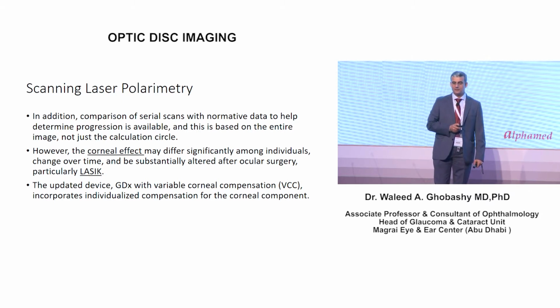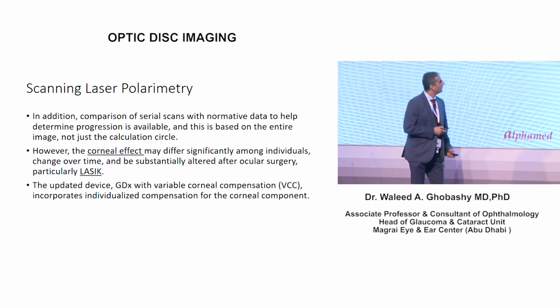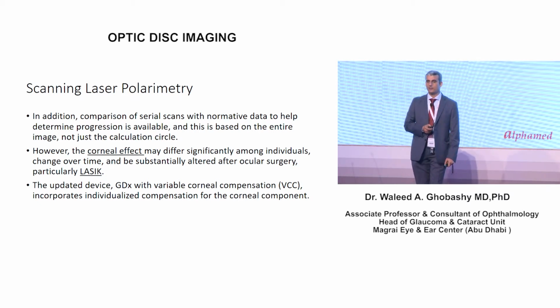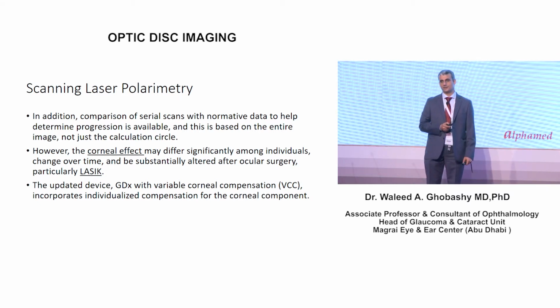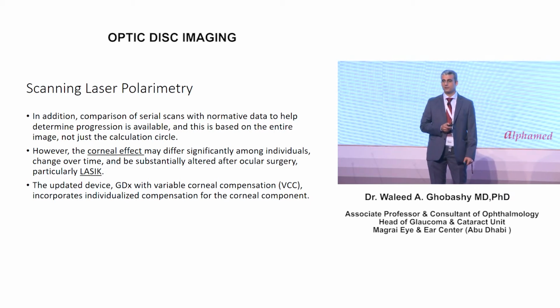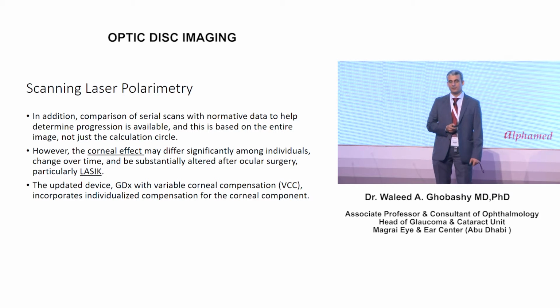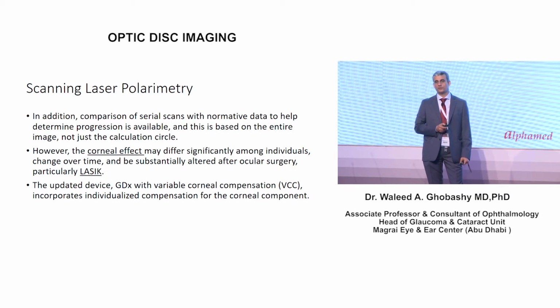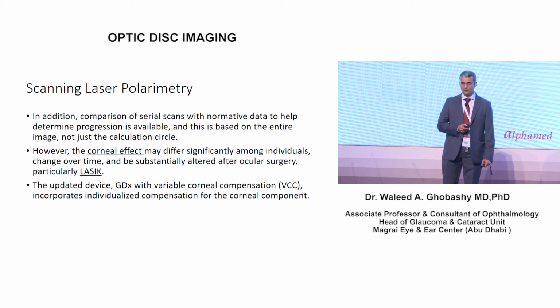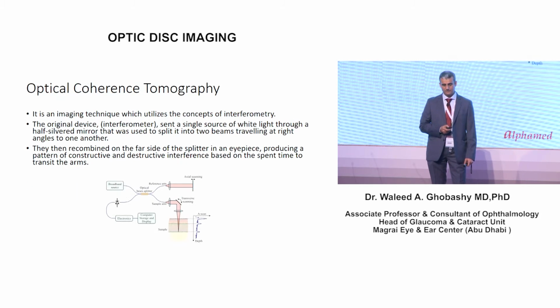The problem with scanning laser polarimetry is usually what we call the corneal effect. It's not that accurate in patients with ocular surface disease disorders, which are common in patients already receiving anti-glaucomatous medication, and it's also not that accurate in patients with previous corneal surgeries like pterygium excision or a LASIK procedure. Still, they are doing updates now to avoid this kind of interference.